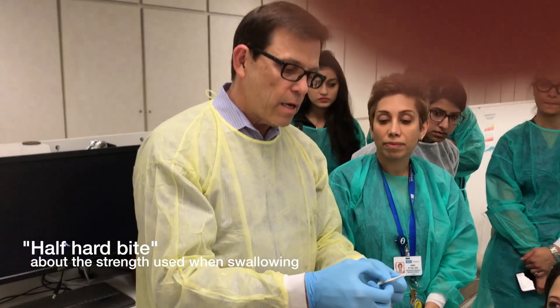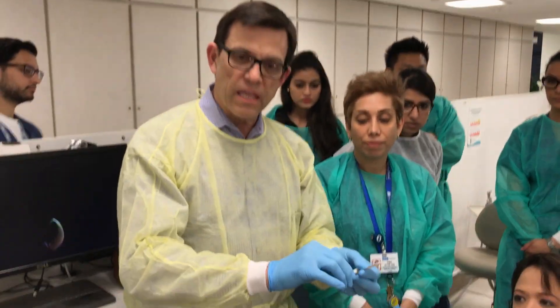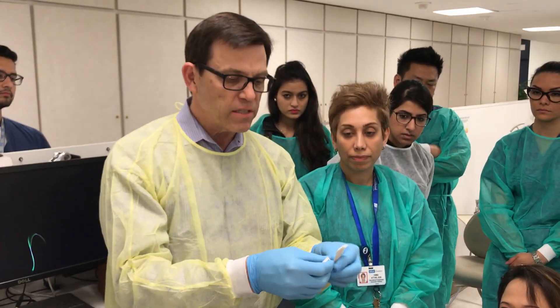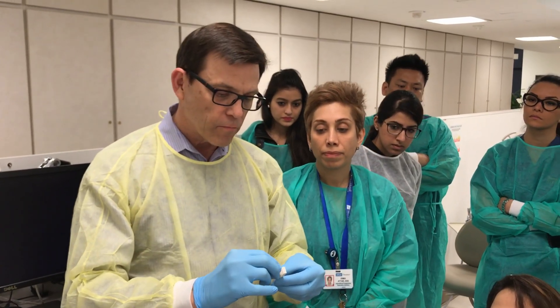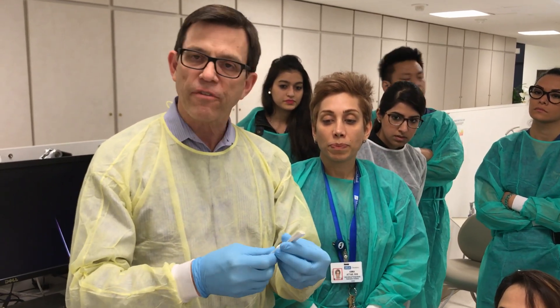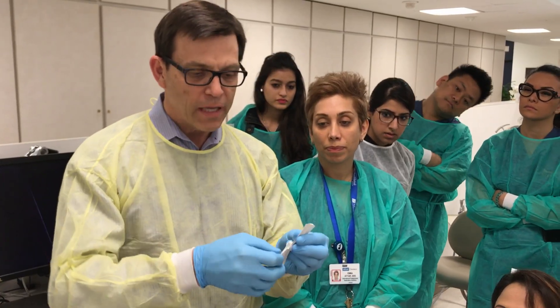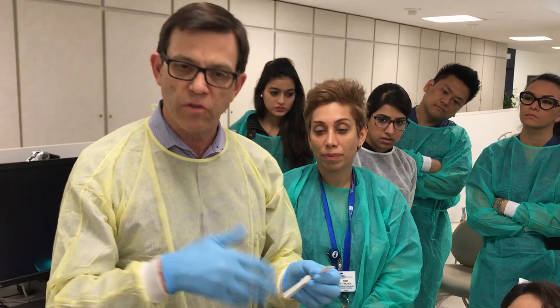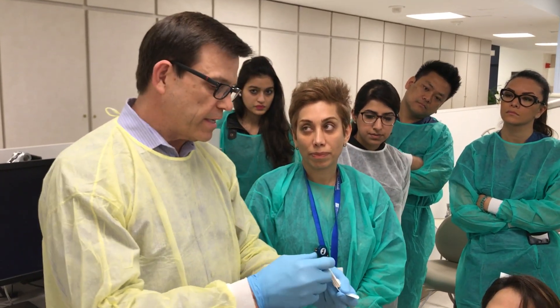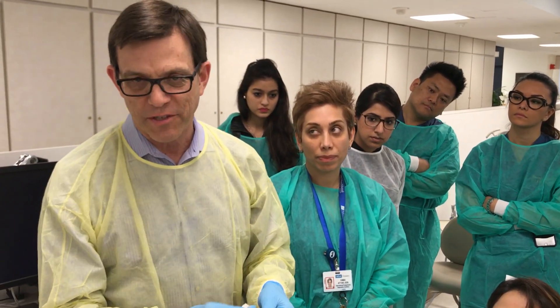And we're going to be reducing the leaves in thickness by just taking a stack off. I typically just take half of the stack, and then I take half of the half, and I take half of that half and so on until I'm down to just a few leaves. It's a quick process. We can basically get through this deck of leaves in short order.